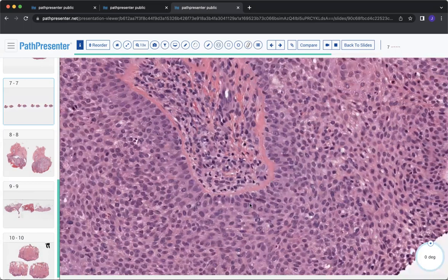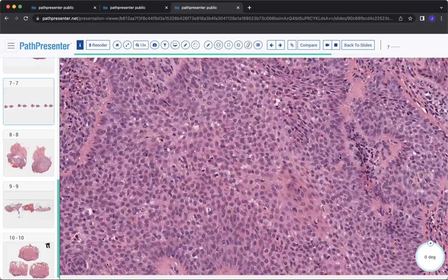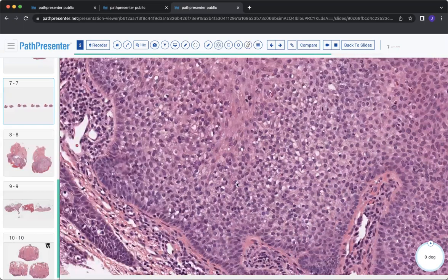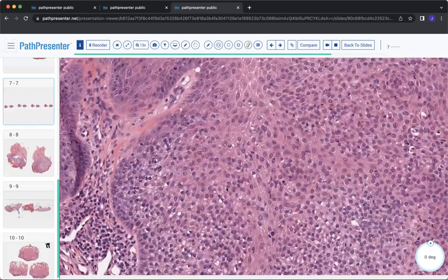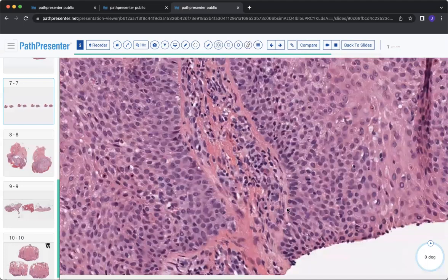So this is another example of a trichilemmoma, more areas of clear cell cytoplasm to make you remember that it's differentiating from the outer root sheath. It's going to be diffusely CD34 positive. And I included a lot of examples of trichilemmoma because they are often forgotten by beginners. And so you have to remember to think about it, okay?